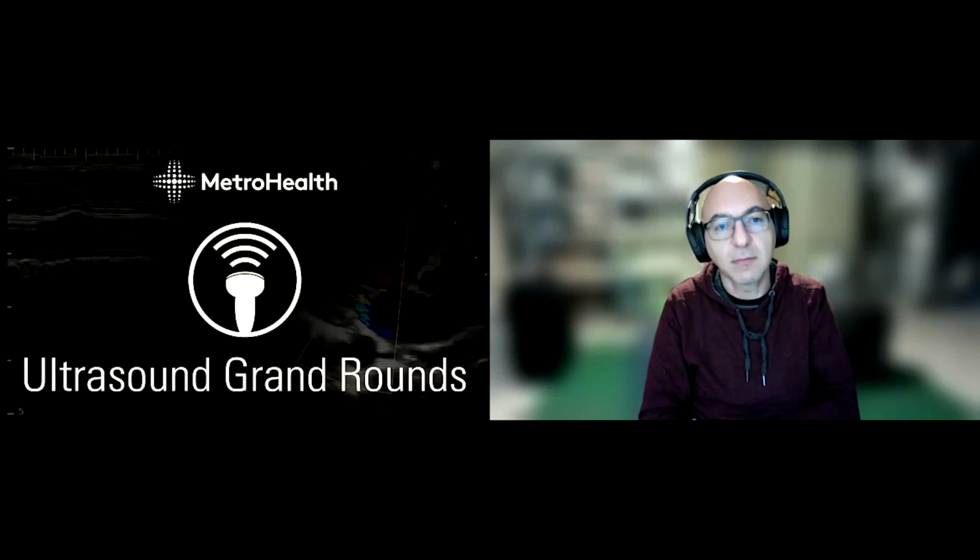I think hopefully this case was helpful as we worked through a case that we saw in the ED and nuanced it a little bit, added some scenarios and played with the different conditions to see how we could use the ultrasound to assess our cardiopulmonary hemodynamics, as well as how we then manage the patient at the bedside and what effects that's going to have.